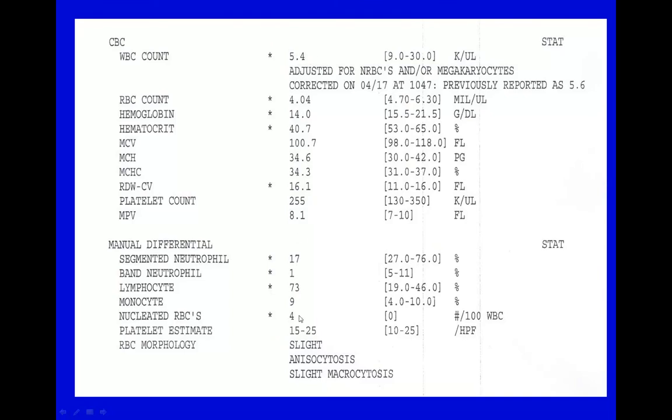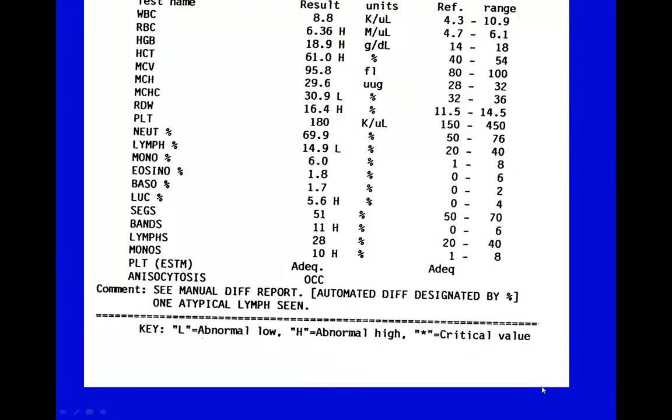And so that's what we're seeing reflected here. They don't have a good ability to fight bacterial infections, do they? Because they have a low band and seg count. The monocytes are within their normal, so we're primarily probably dealing with some sort of infection or inflammation, not because the white blood cell count was high, but because it was low. That can mean that we have some sort of condition like that.